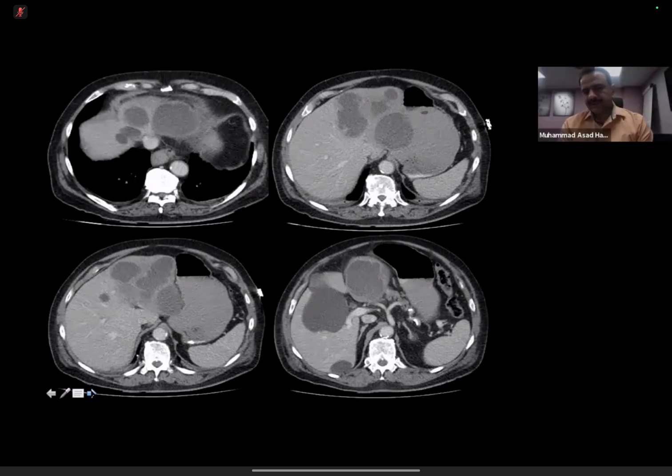So describing the Seldinger technique very well, and normally in interventional radiology, it could be small size drain or large size drain. They can be self-locking, unlocking. Some drains can be sited directly by direct puncture. That is not a Seldinger technique. But for safety, normally it is recommended that for such situation, especially going for the liver tissue, one must use the Seldinger technique to be on the safer side.